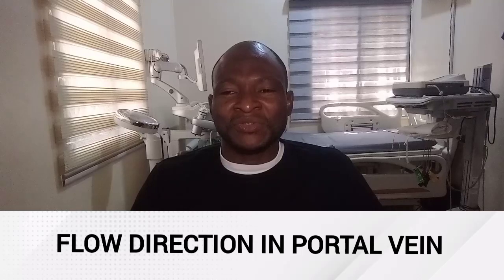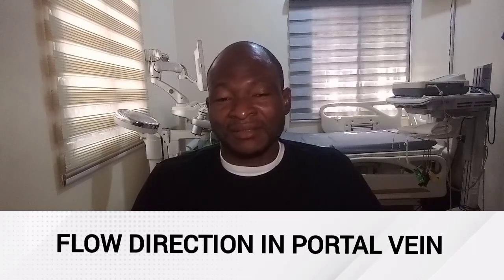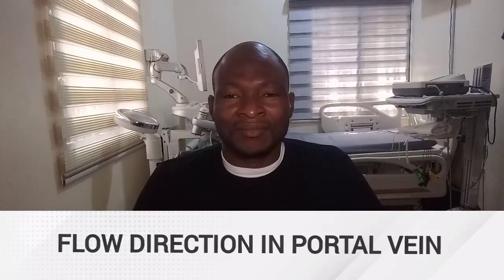The portal vein velocity and flow. The normal flow velocity in the main portal vein is about 15 to 18 centimeters per second. In patients with portal hypertension, the velocity and flow in the portal vein are usually decreased. Gastric vein diameter or coronary vein diameter: in patients with portal hypertension, the coronary vein, that's the left gastric vein, may be dilated.